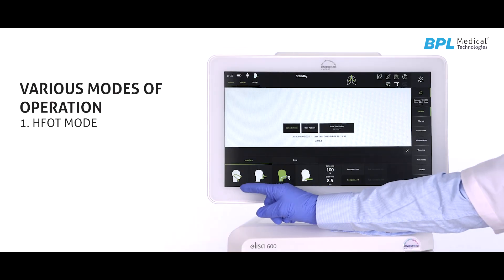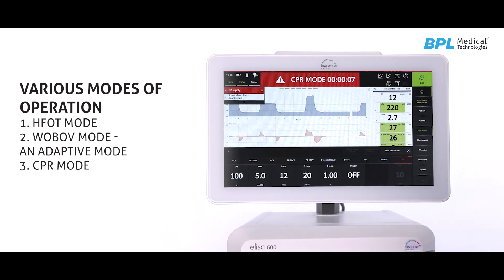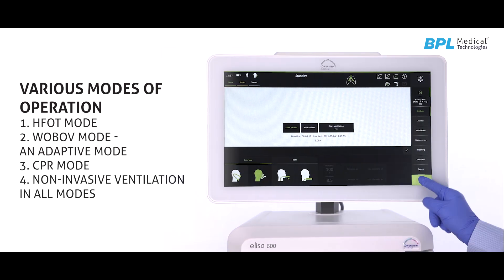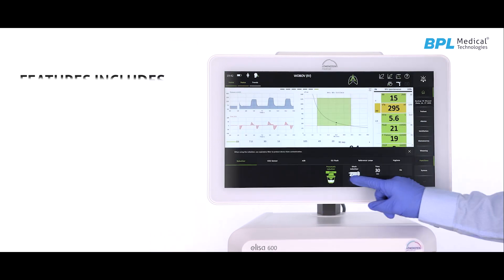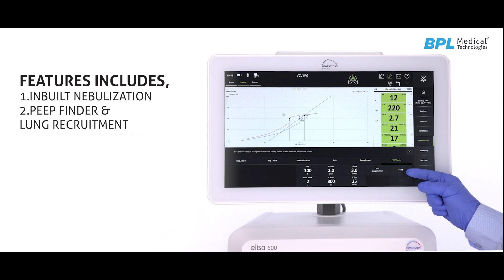Available modes include HFOT mode, WOBOV mode and adaptive mode, CPR mode, non-invasive ventilation, and all modes. Features include in-built nebulization, PEEP finder and lung recruitment.